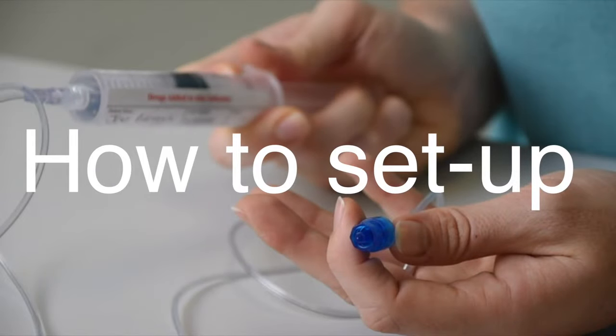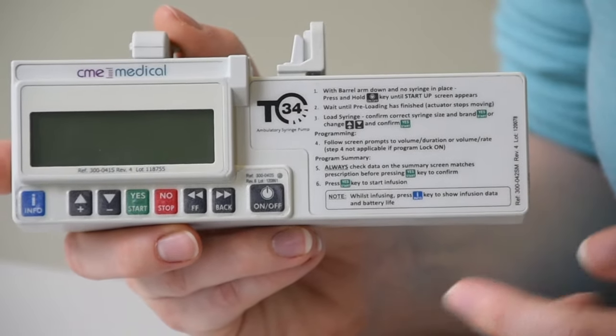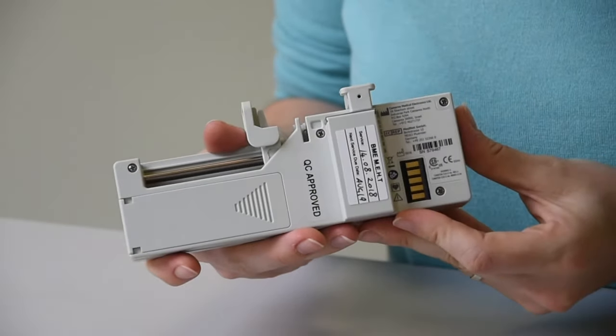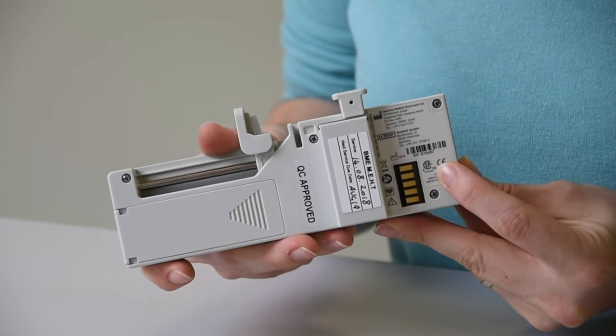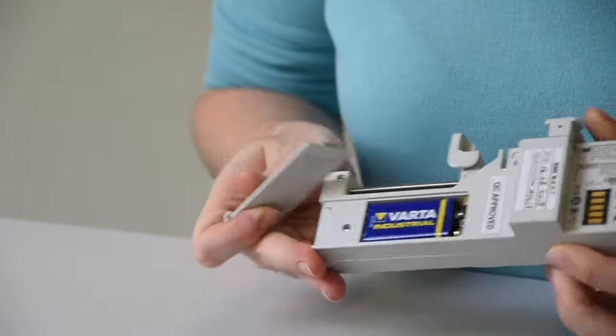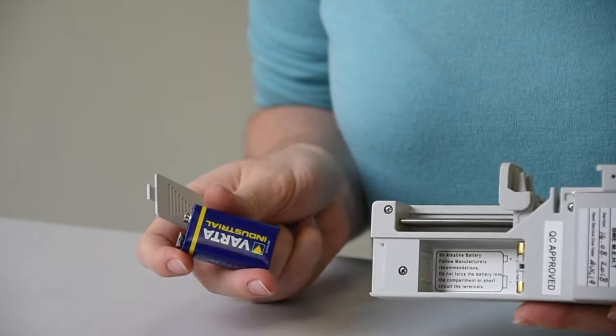How to set up. There are instructions on how to use the pump on the front. You will find the buttons here along the bottom. At the back, you will find a serial number. You will also find the battery. Open and close like so. This is a computer, so please be careful not to drop or damage the pump.